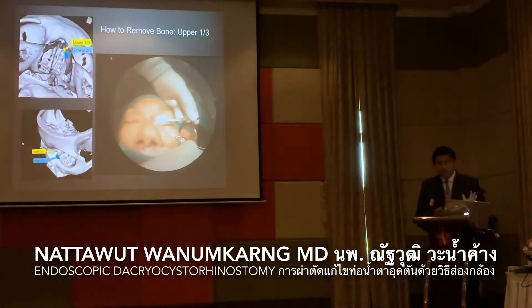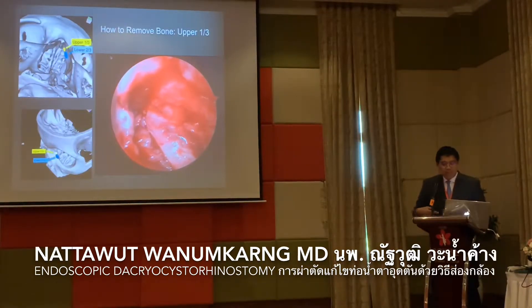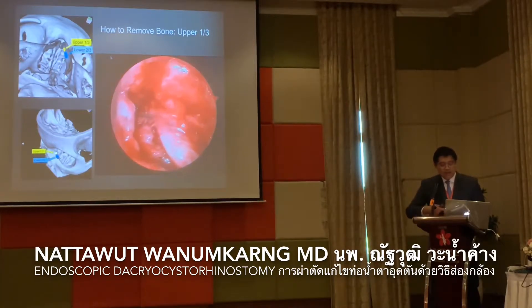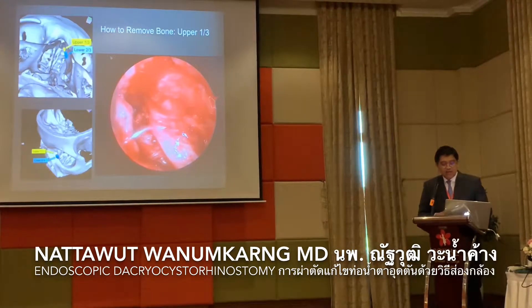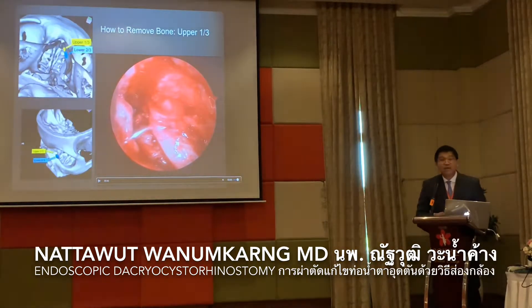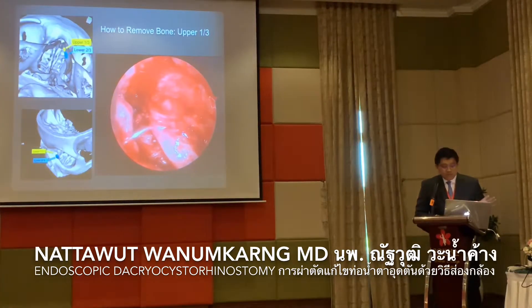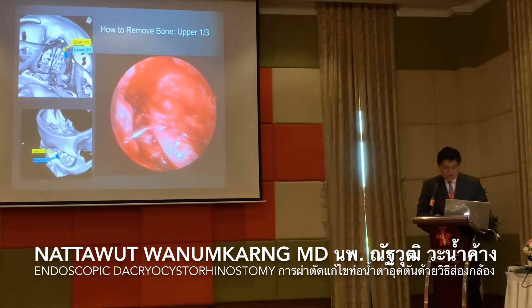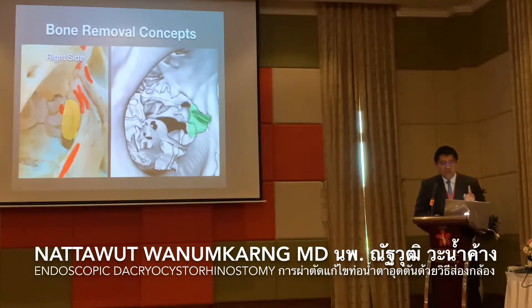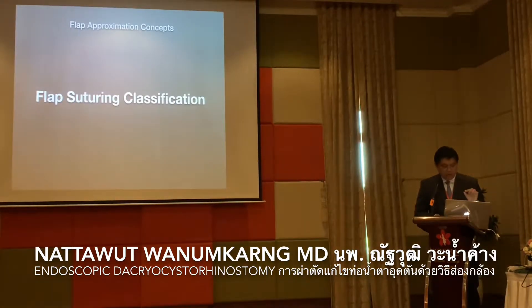This endoscopic video shows how to estimate the adequacy of the bone. You apply the probe in the horizontal dimension and then rotate backward about 45 to 50 degrees. This shows the area of the upper one-third that we should remove. I found that without removing this portion, my failure rate was about five to ten percent. After removing this area, the success rate increases to nearly 100 percent. This is good anatomy showing adequate bone removal and the resulting nasal ostium.